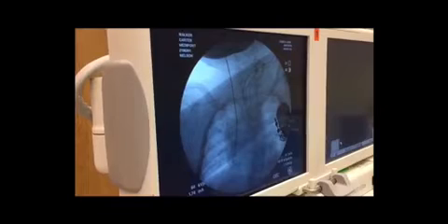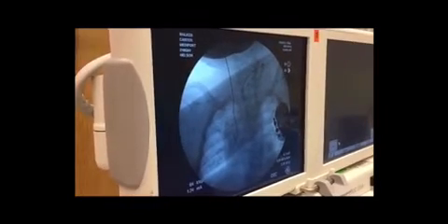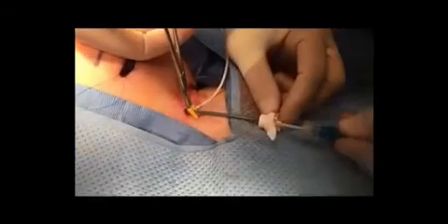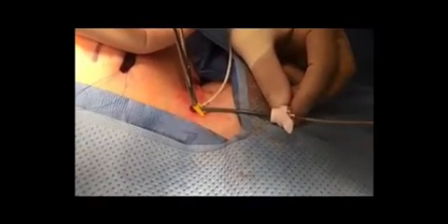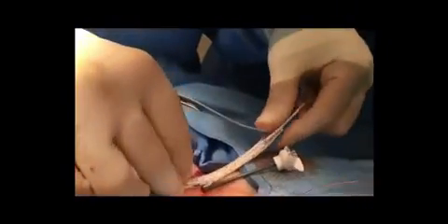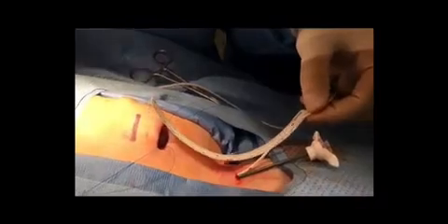Once the wire is placed into the vein, we watch under fluoroscopy as we pull back on the wire until the tip is exactly where we would want the tip of the catheter to be. We then mark the wire either with a marker or with a very slight crimp using a needle driver. We then place the dilator over the wire and remove the wire and clamp the dilator. We then measure the distance from the tip of the wire to the crimp and then cut the catheter as it's exiting the skin to exactly that length.